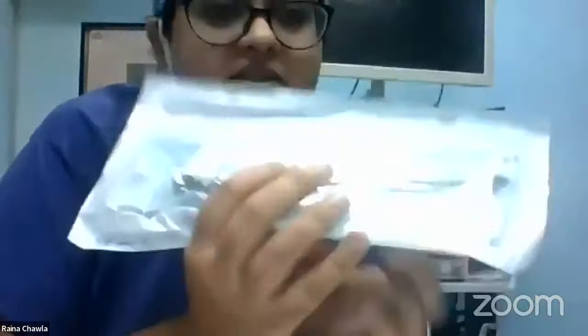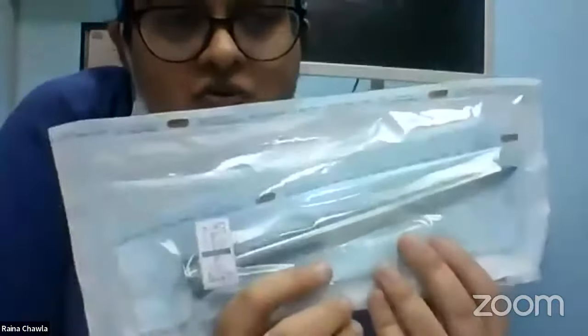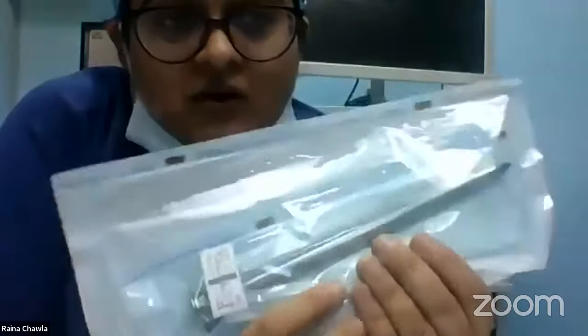Okay. So how do we introduce this? This will go through a primary port. Now, what is a port? We've created pneumoperitoneum with this. We introduce this. Okay. This is called a trocar and a cannula. It's basically a hollow instrument. Okay. I'll open it and show it to you.